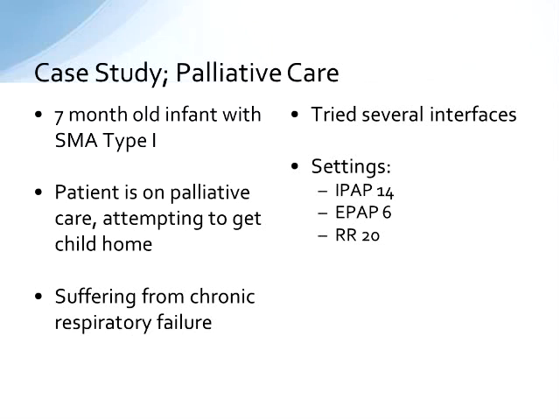So again, PC-SIMV plus pressure support. And we were able to successfully ventilate this child and prevent atelectasis. Certainly something this kiddo was having was worsening and increasing incidence of atelectasis, and in this case a little bit of pneumonia.